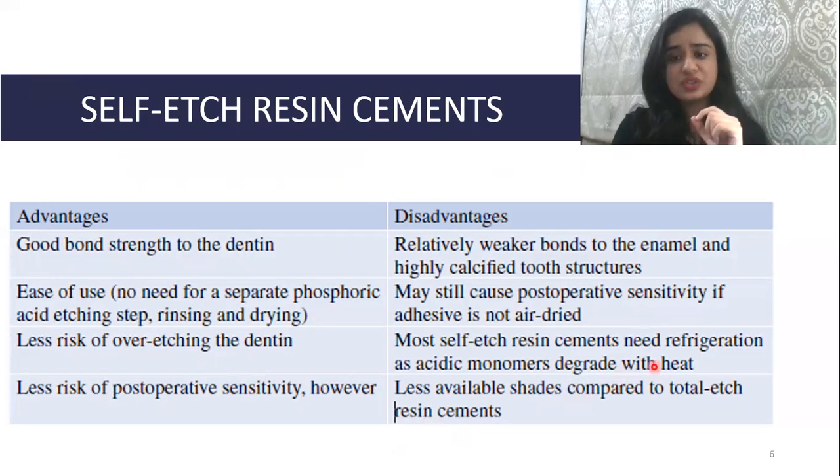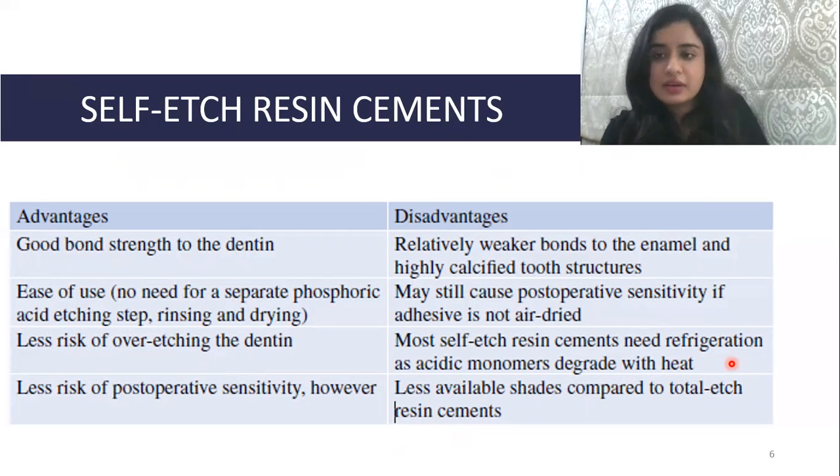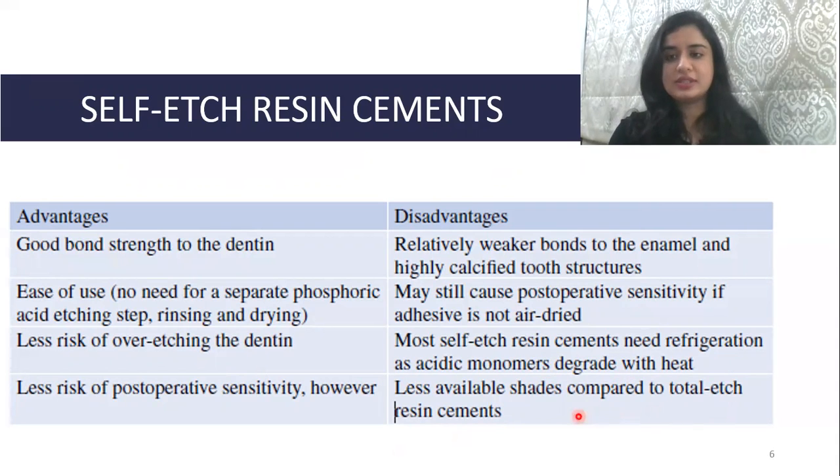So most self-etch resin cements need refrigeration as acidic monomers degrade with heat. This is another important factor, and there are less available shades when compared to total etch resin cements.